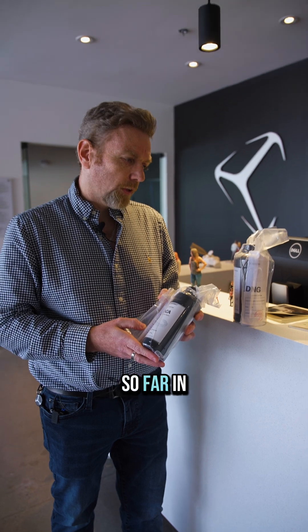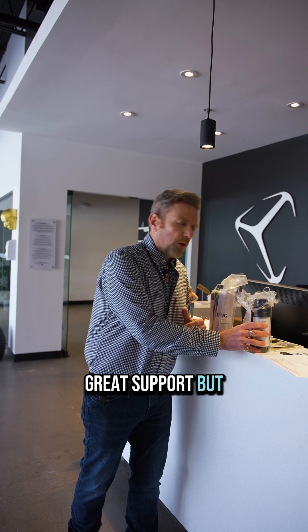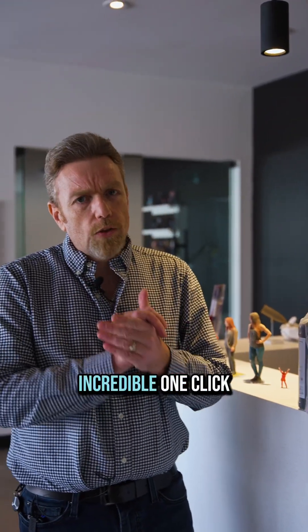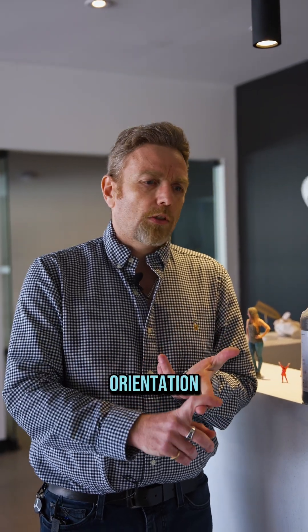Every experience I've had with Luxe Real Printers so far in the three years we've been using it has been fantastic — great support, a great workflow, and really incredible one-click software, so you don't have to set up supports or set up orientation.